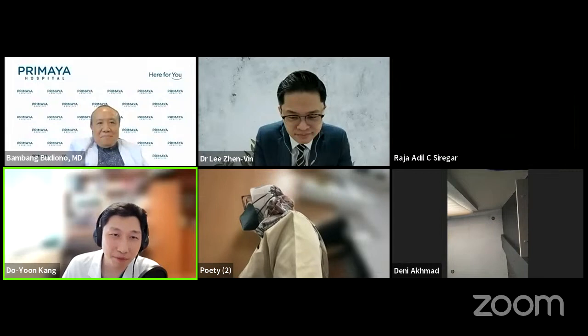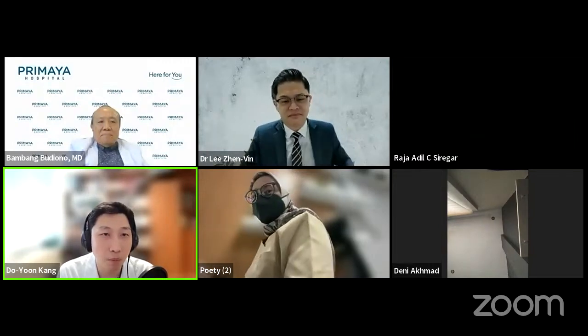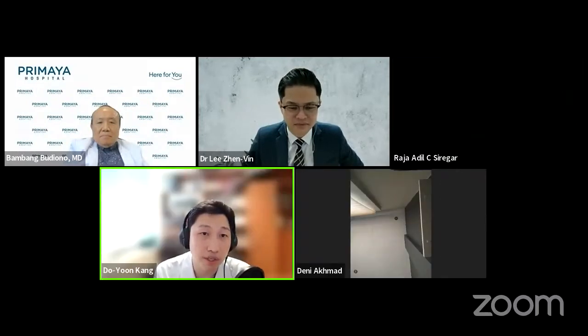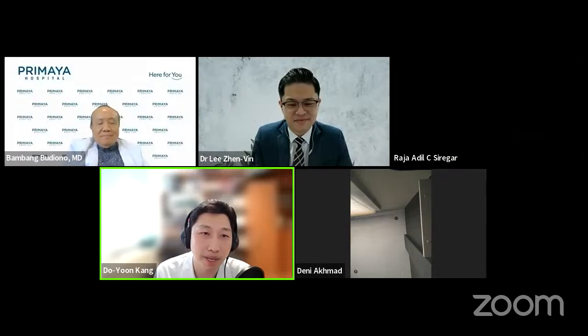That's a very excellent question, and we have a lot of things to discuss about that. But actually, there is no robust data yet about that. In our center, we also recommend FFR-guided revascularization in many patients, even for CABG, because there are many vessels with intermediate disease, and surgeons do not know which vessel is significant. The 50 to 70% stenosis is very visual, it's not accurate. Everyone says different numbers. So FFR can guide those patients to the significant ischemia-producing lesions in CABG.